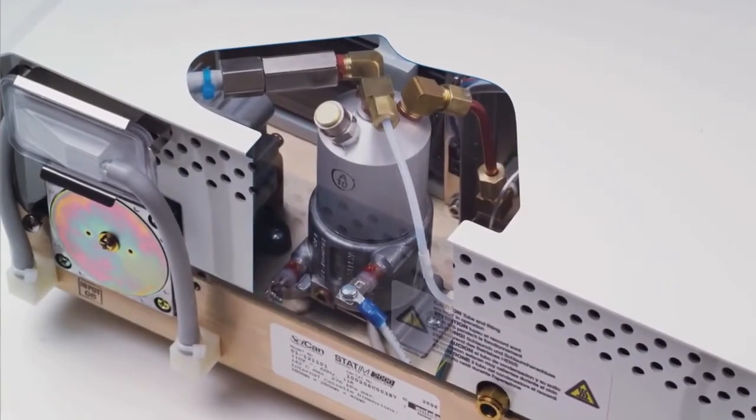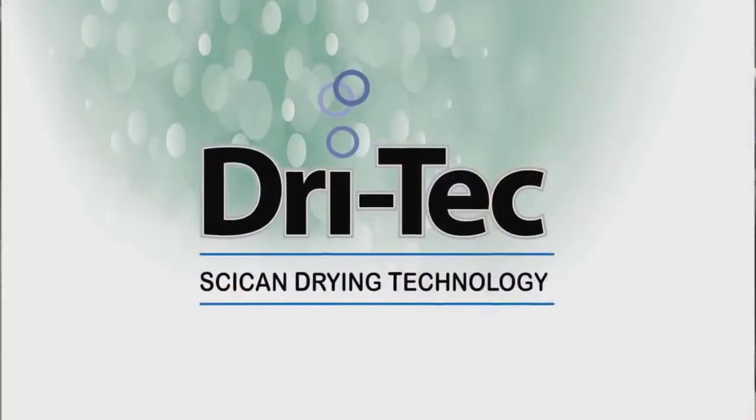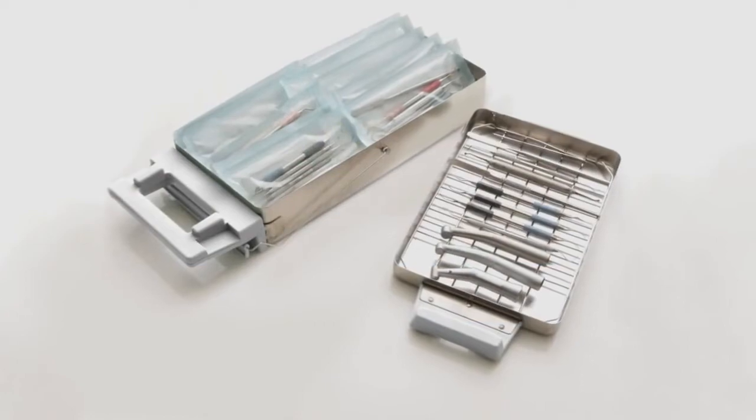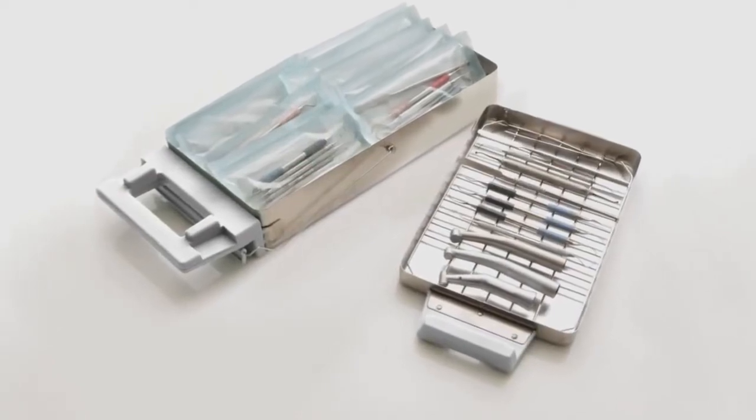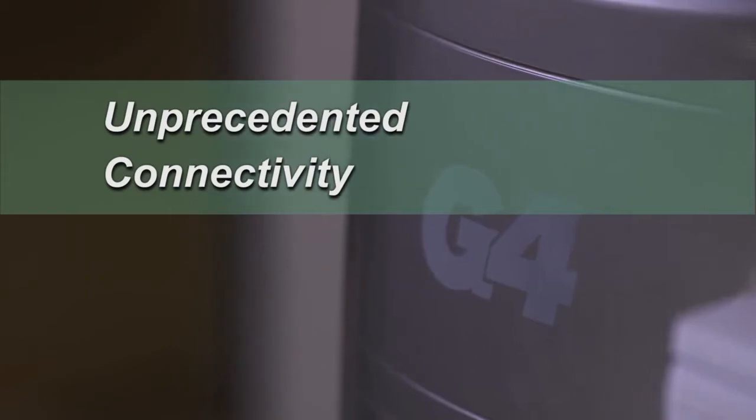SciCan's signature STEAM technology — the fastest, gentlest sterilization available today — and DryTech technology, that ensures your instruments come out dry each time. The features that made Statum the standard in infection control in the dental office have now been significantly advanced.